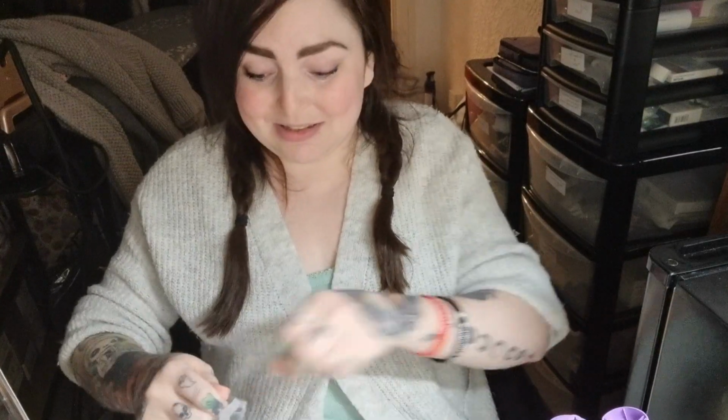Not sure why. In the Flow Care, this is just a giving set, so inside here has all my tubing. I should have opened it so that it wasn't all crackly. And this is the second little giving set. It's a little adapter called a cross spike adapter. Ta-da! And it's little sterile packaging that's going to make lots of noise.